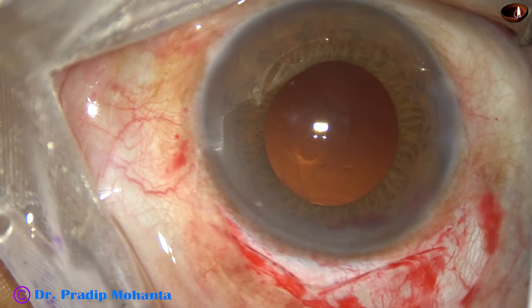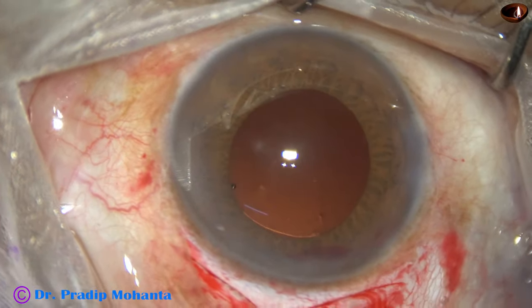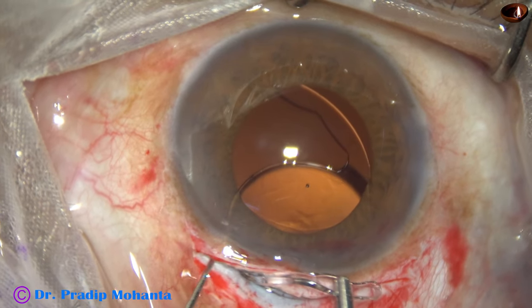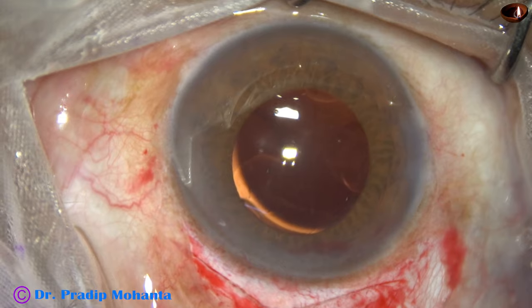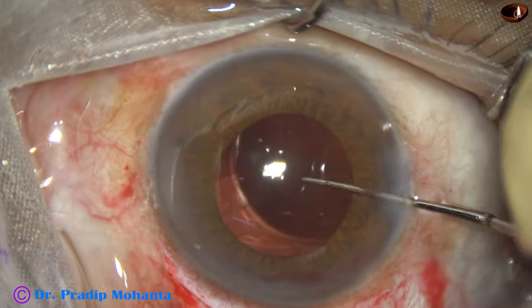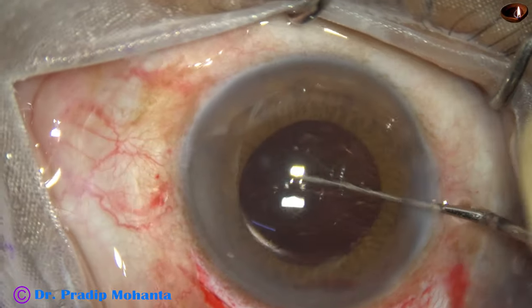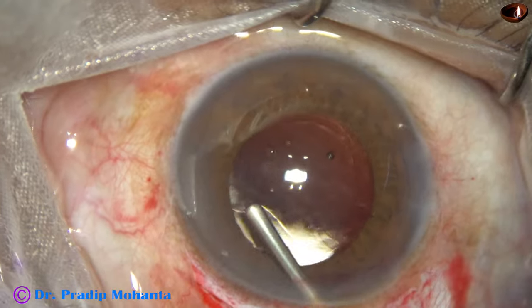The anterior chamber and the capsular bag are filled up with 2% hydroxypropyl methylcellulose. In this case, we are implanting a foldable intraocular lens because we did not have a proper rigid lens with the selected power. This lens has been guided by the Szynski hook and it is now placed into the capsular bag. The other haptic is also in the bag.